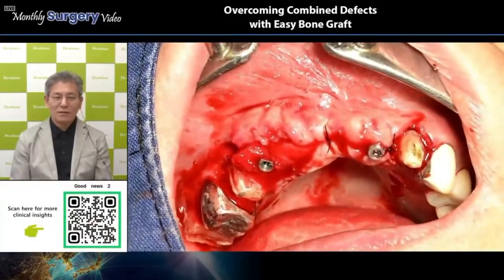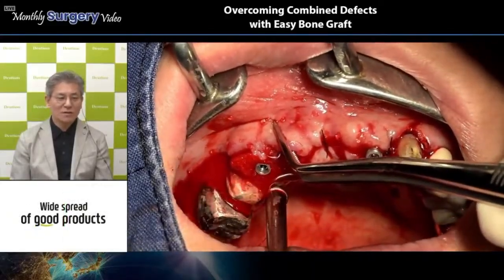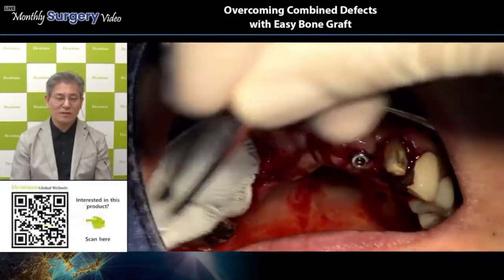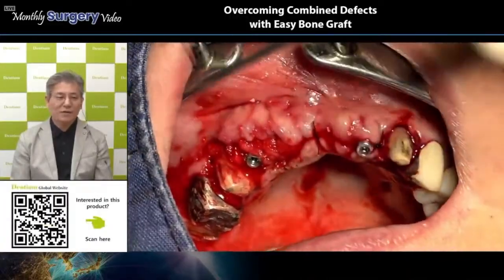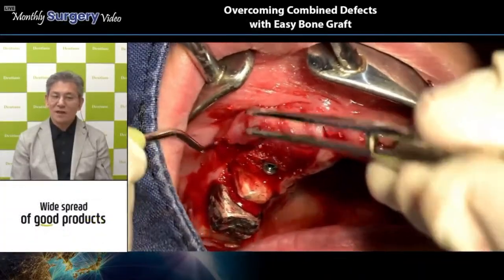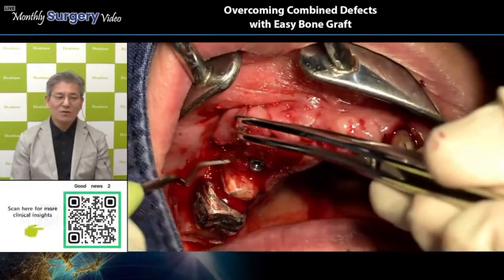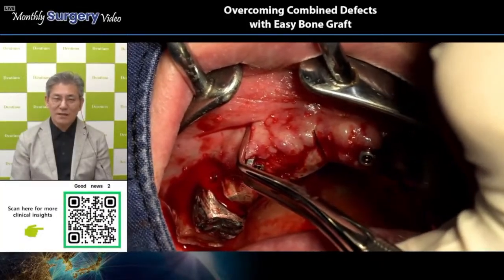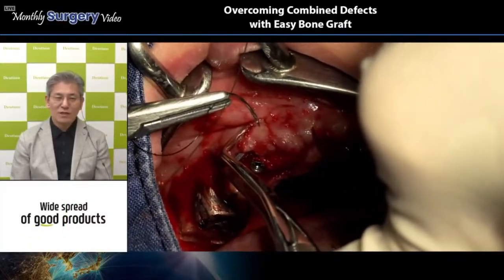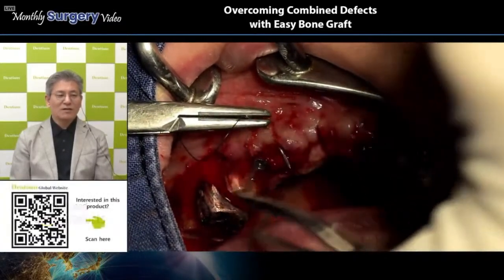Normally, the barrier membrane has a 4 to 6 months resorption time, so it stays there on this GBR site for a minimum of 4 months. However, the normal resorption time of this collagen graft is 1 month. One month is not enough for new bone formation, as you know. However, this easy bone graft concept is not the same as the regular GBR concept, right? So this is the easy bone concept.